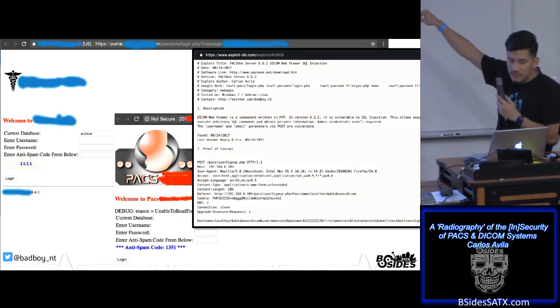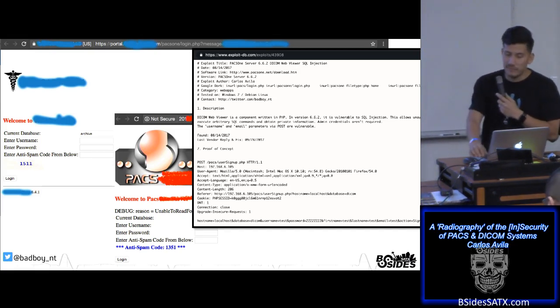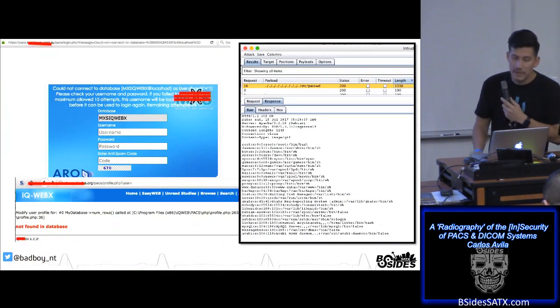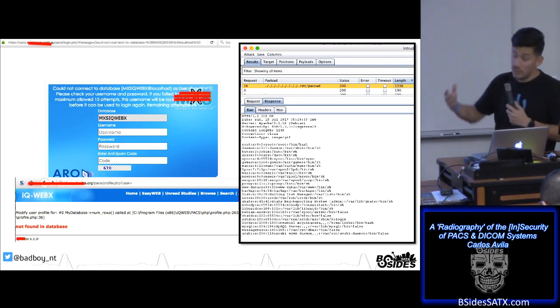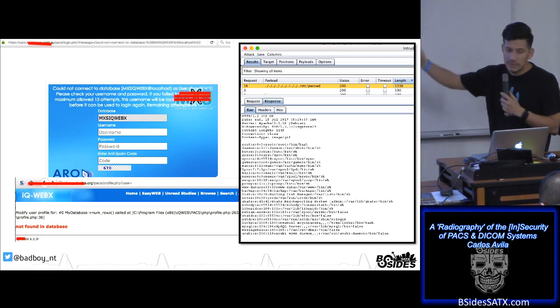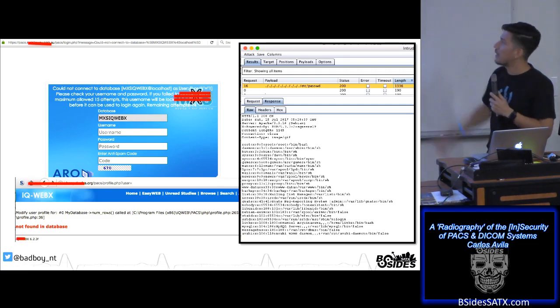This is one vulnerability, SQL injection over PACS One Server, used to obtain patients' data from facilities that have implemented that specific version of PACS server. This is the other evidence, but commercial software embeds PACS One with some customization with the same vulnerabilities, and a potential attacker could extract all patient information on these servers, depending on the configuration. This is the other vulnerability on the same software, local file inclusion, a typical web attack.